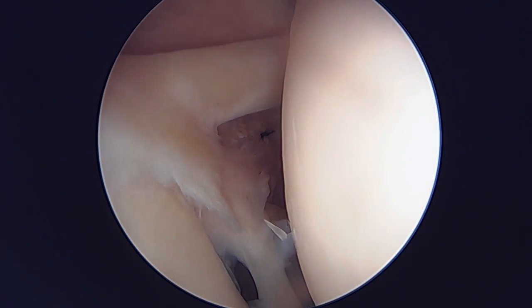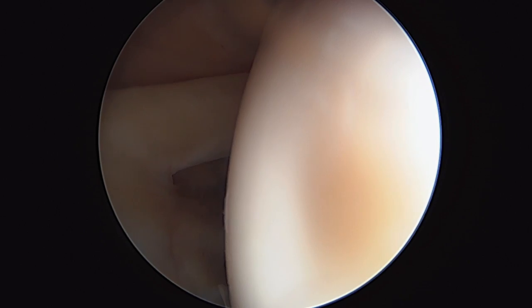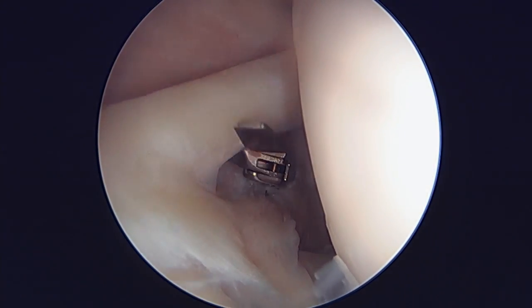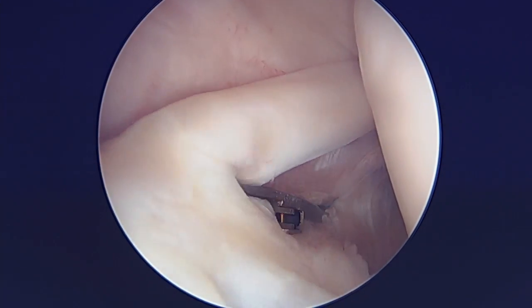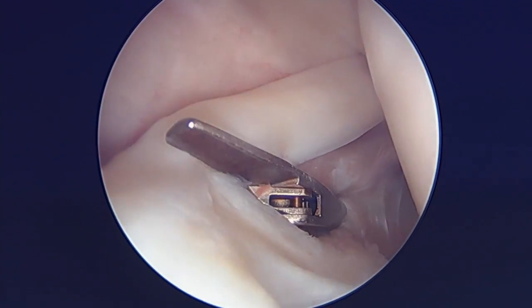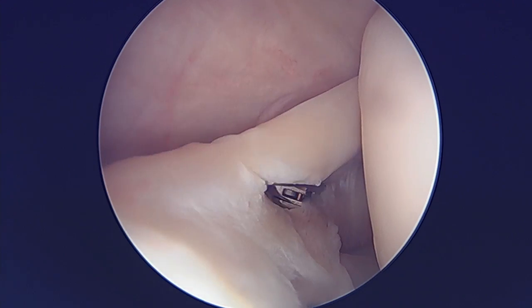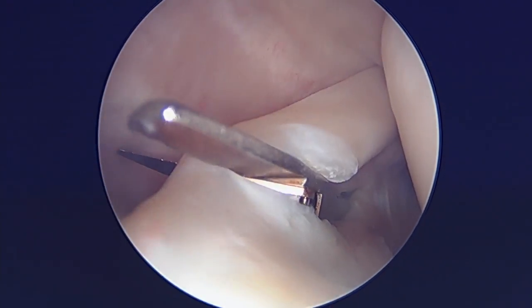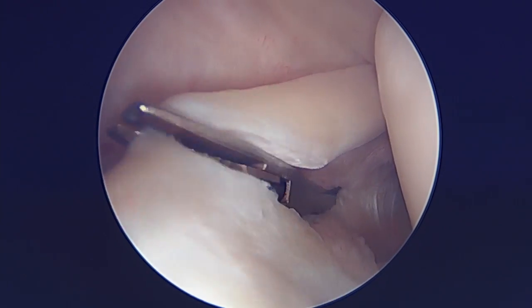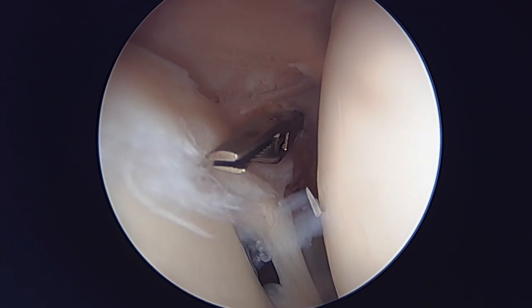I'm going to take my arthroscopic scissors here and come in the front again. We're going to go ahead and perform our biceps tenotomy. You can see that's getting completely around the long head of the biceps tendon. And that's done — we've released the biceps tendon.